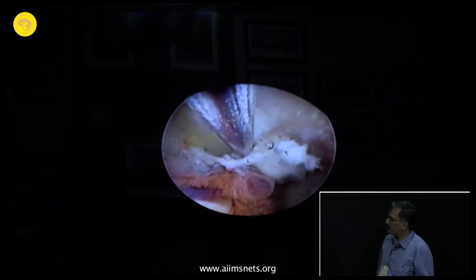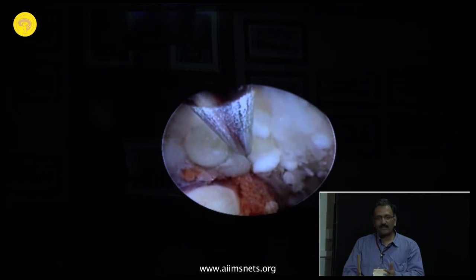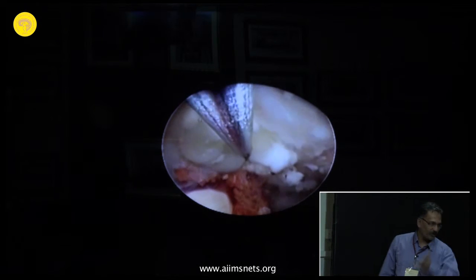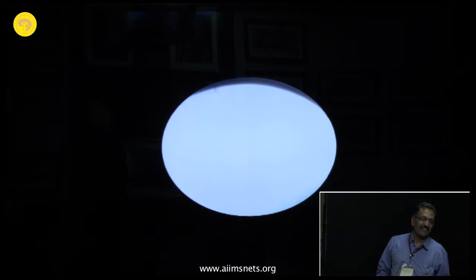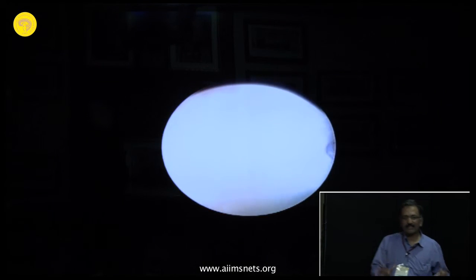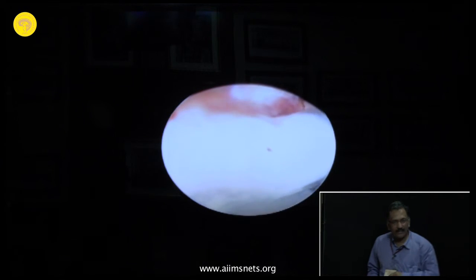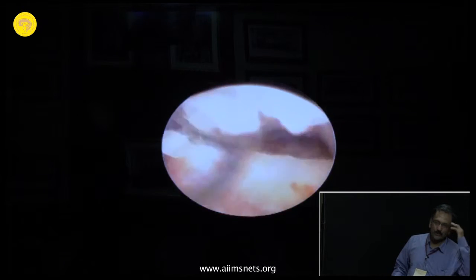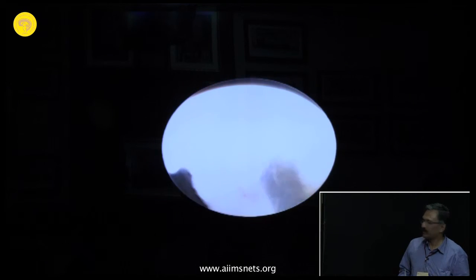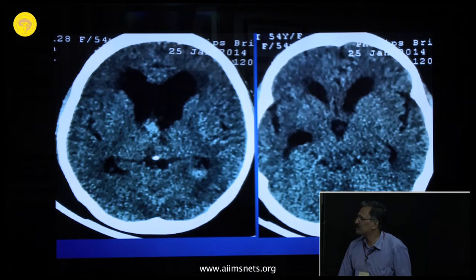So what I'm trying to say is that there are some other very interesting problems which arise when you do all these endoscopies, and with experience you need to innovate, because right now I think the technology has not progressed enough for us to deal with every situation. So we have to continuously innovate when we are doing the procedure. These are some of the situations I wanted to talk to you about. And this is, of course, the post-operative picture.